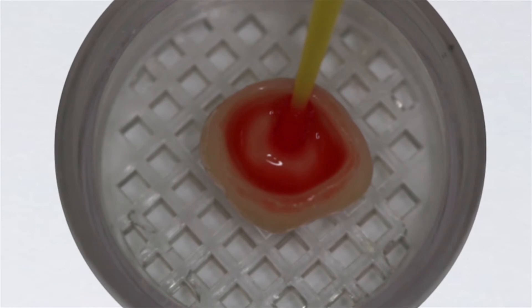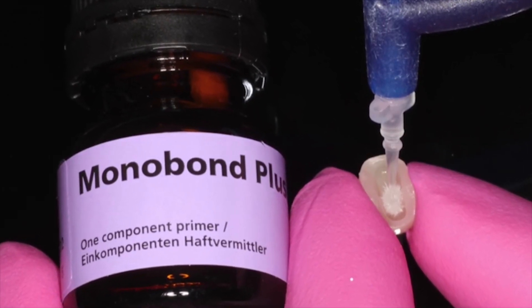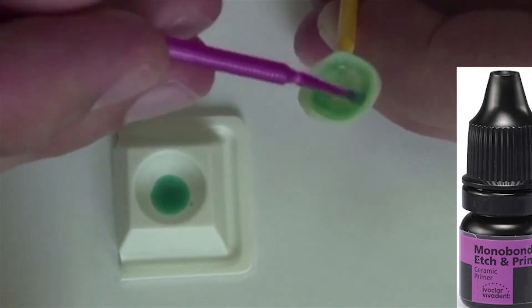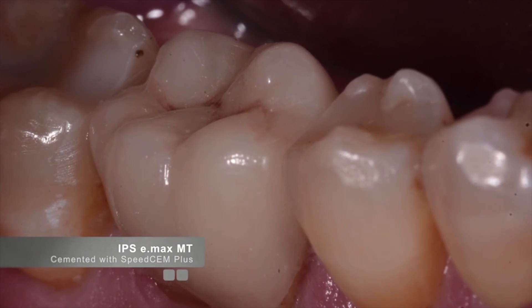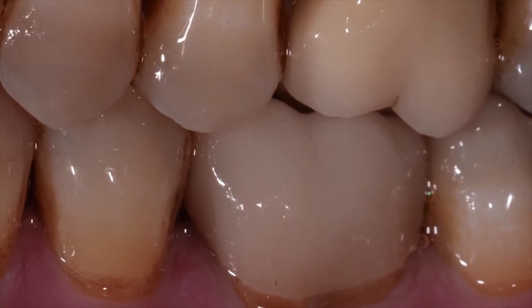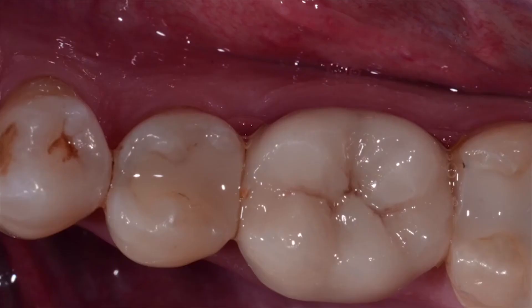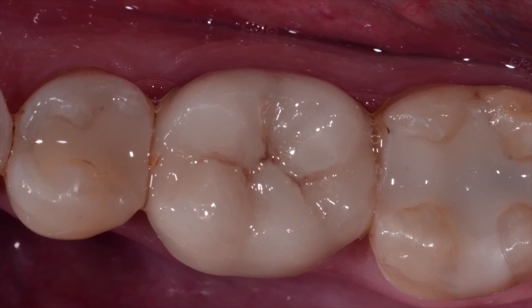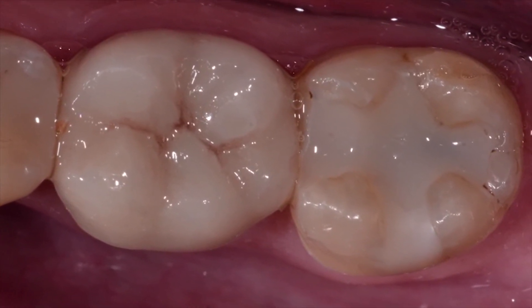The internal surface of the restoration is etched with hydrofluoric acid for 20 seconds, followed by an application of Monobond Plus. An alternative would be to use Monobond Etch and Prime, which does both etching and priming in a single step. The tooth was isolated to retract the tongue and cheeks. The patient had a severe gag reflex, so while a rubber dam or Isolite is preferred, due to how easy it is to use SpeedCem Plus, the decision was made to only use cotton roll isolation. The cement was placed in the restoration and the restoration seated. The end result is a harmonious restoration that blends in easily with the surrounding dentition.